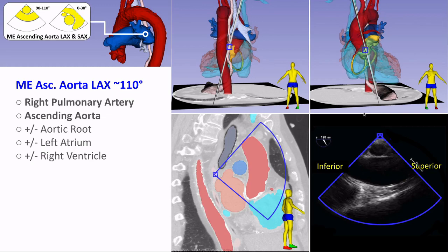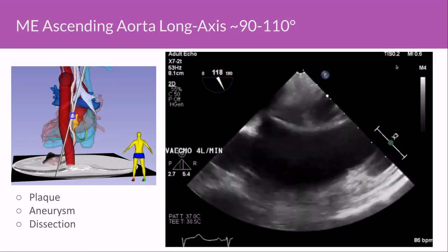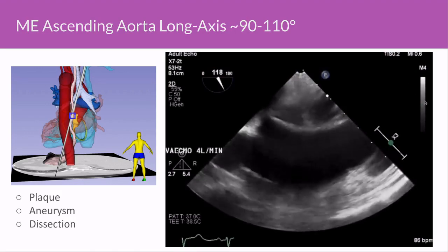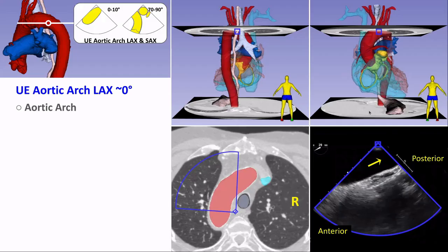The long axis view of the ascending aorta from the mid-esophagus shows the right pulmonary artery in short axis and the ascending aorta in long axis — a good view for detecting atheromatous disease in the ascending aorta. As you pull the probe up further, you go through the blind spot behind the left main stem bronchus. Going past the blind spot, you come upon the arch, and at zero degrees you have the aortic arch long axis view, where you can assess arch flow, potential dissection, or dilation.